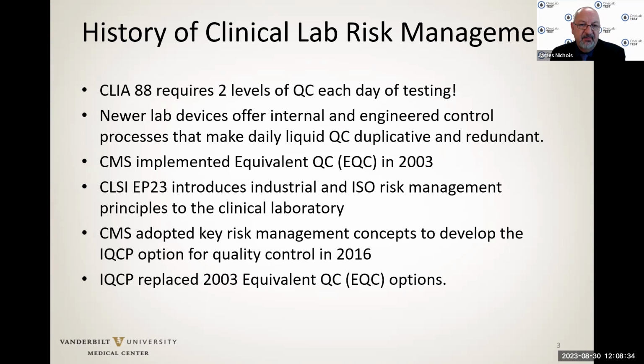The Centers for Medicaid and Medicare Services, CMS, implemented equivalent quality control in 2003 as a means of adjusting to all of the newer point-of-care devices that were coming out on the marketplace. But that wasn't really scientifically based. So a conference was brought together, and out of that conference, we had a number of experts that proposed and developed EP23. This was the first document that introduced industrial and ISO risk management principles into the clinical laboratory.